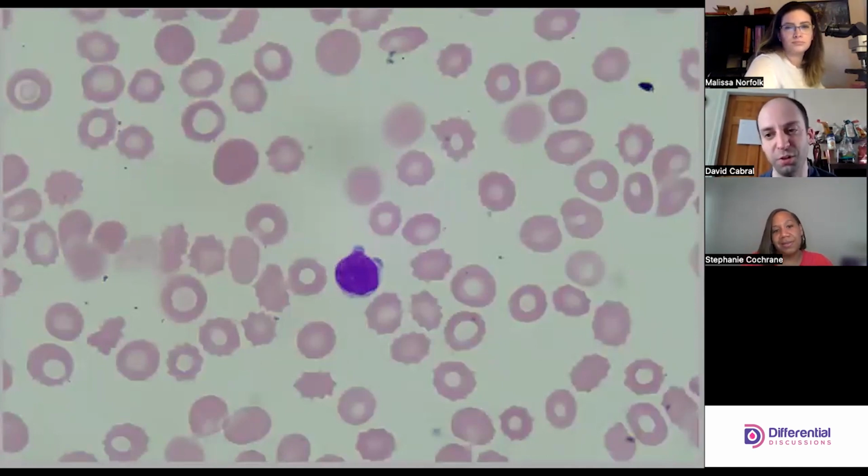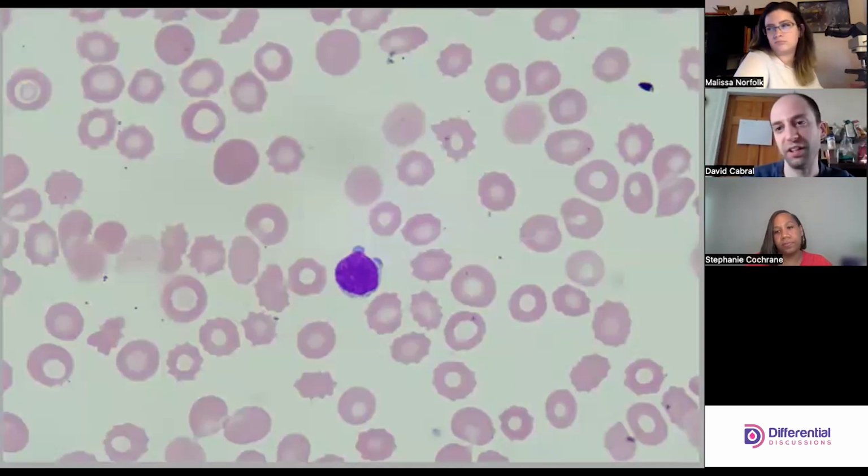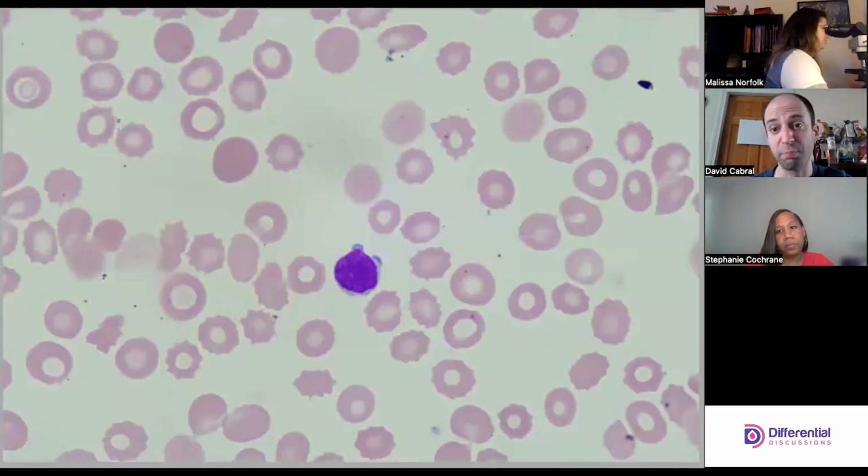Hard to see a lot of detail in the nucleus there. But size-wise, it looks to be mature. Yes, I agree. ALL sometimes though can just not look like most myeloblasts that I've seen in my career, which are very blasty, in air quotes. Lymphoblasts can look a little wonky, but I think just lymph on this one. There's no reason to jump off. But those burr cells are still there. They seem to be persisting.